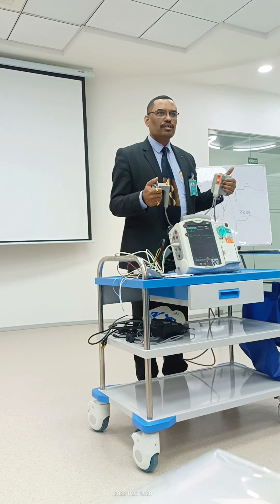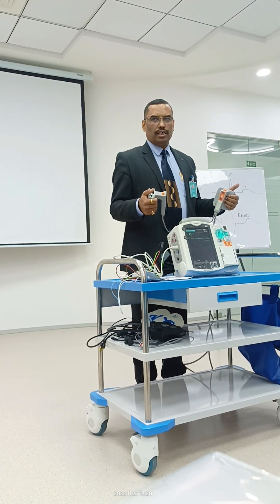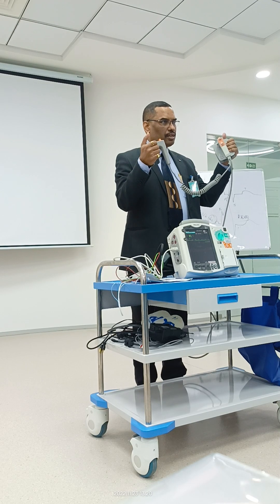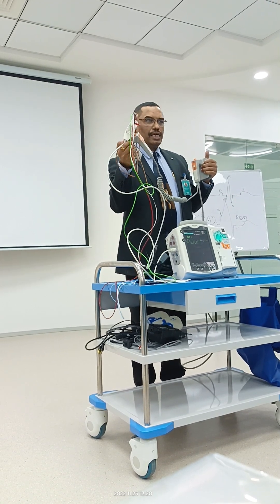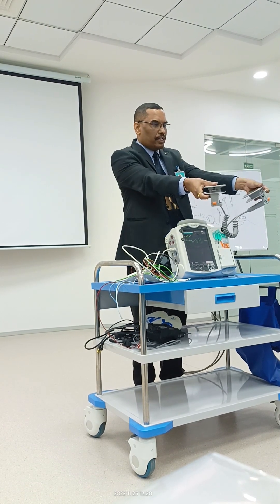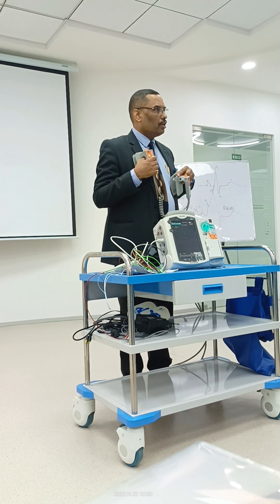You saw the sinus rhythm — that is my rhythm. You got a sinus rhythm and now you're getting the beep sound. So you can do this without electrodes. This is the ECG cable — I can connect this to the patient instead. Instead of this, I'm connecting with the paddles. The steel part should be connected to the patient's chest properly, then you will get a proper rhythm.